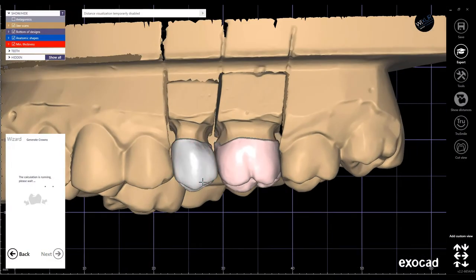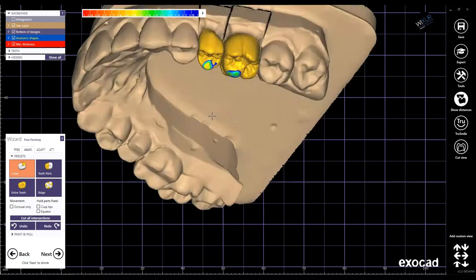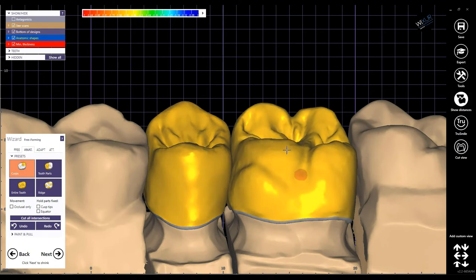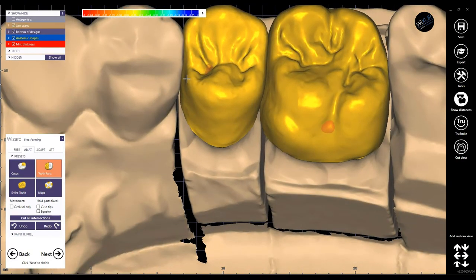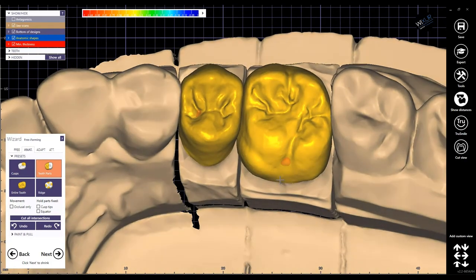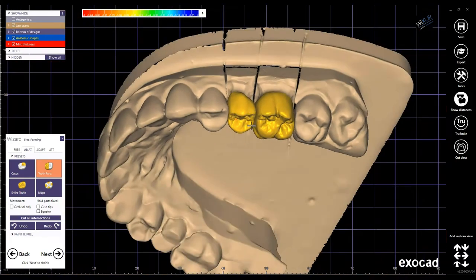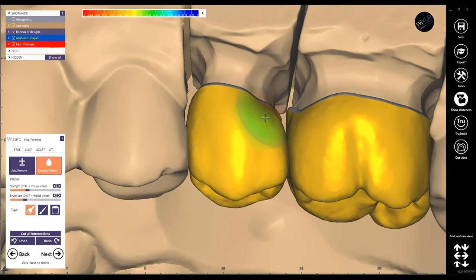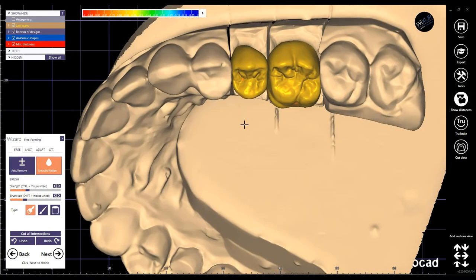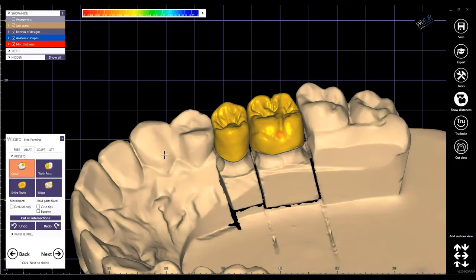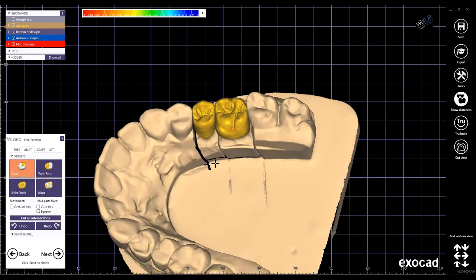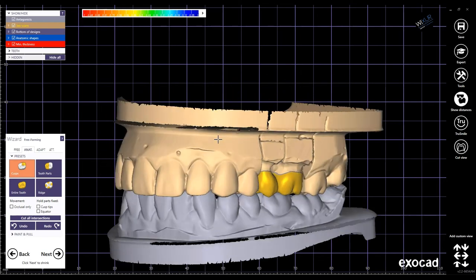Click next. Now it's time to do some free-forming here and adjust the antagonist, and also the adjacents. I do them faster here because the target is tooth reduction and the cutback technique, not free-forming or tooth placement.